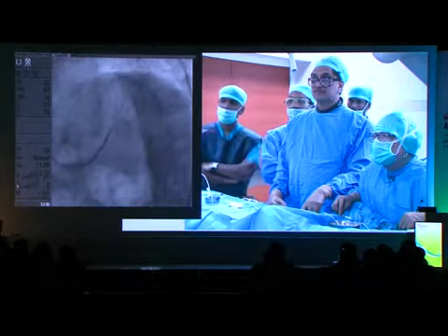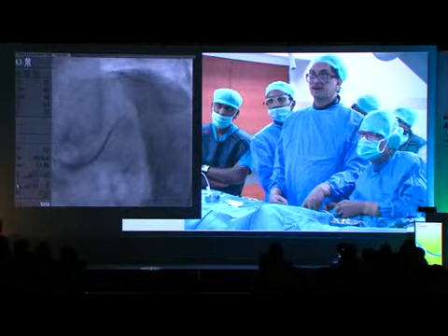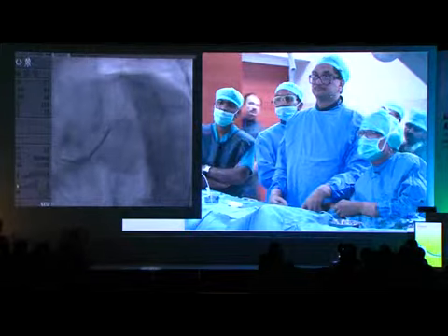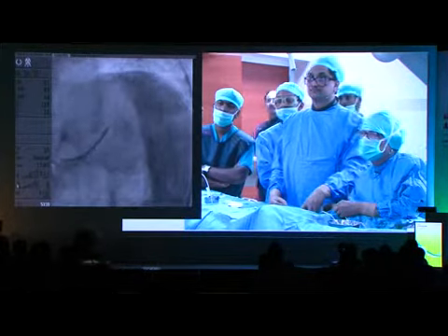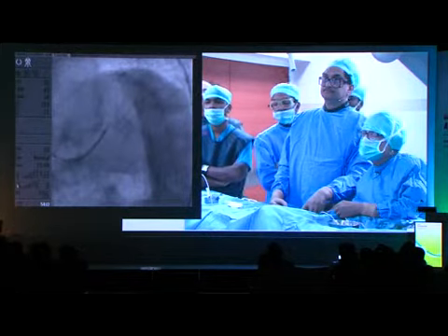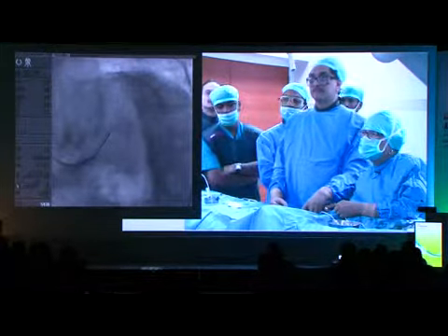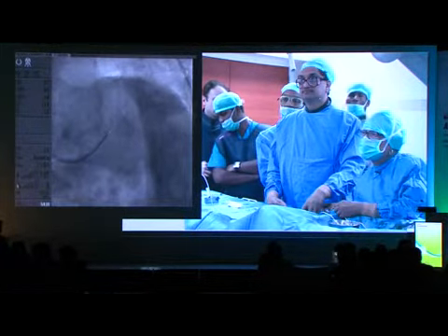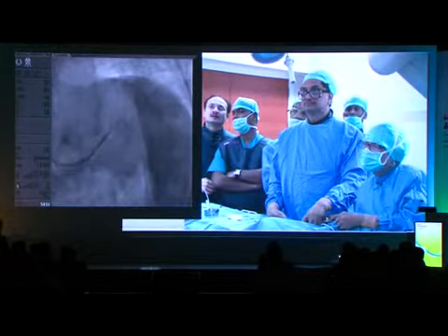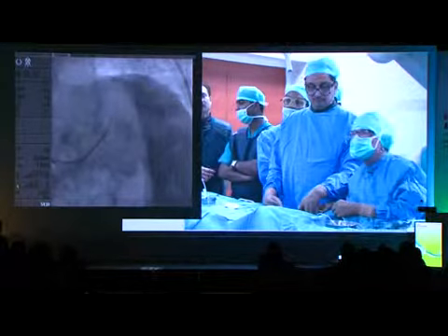The problem is that the catheter doesn't turn, which is not so surprising. Take a little bit stiffer wire, I think. Yeah, we will have to finish with a stiffer wire. But let's say, always prefer to begin with a softer one, because it's something recent. It should be easy to cross, but it's not.